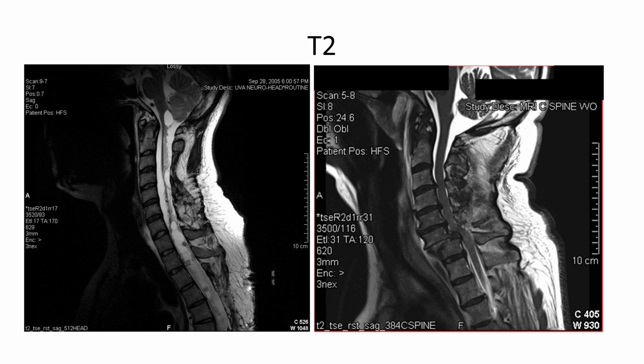The next image shows what are obviously MRI scans. So these MRI images are of the spine. Typically with the spine, we like to do T2 images because it shows us the cerebral spinal fluid as bright white, and it shows a nice image of the spinal cord that looks like the natural tissue.